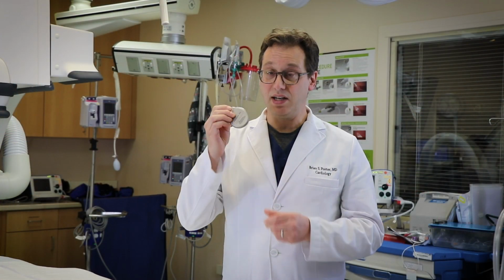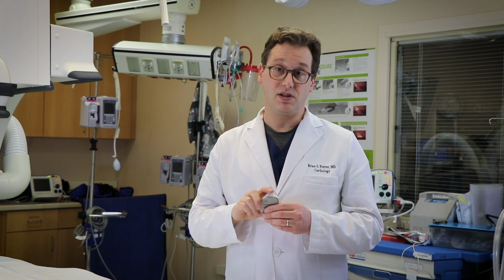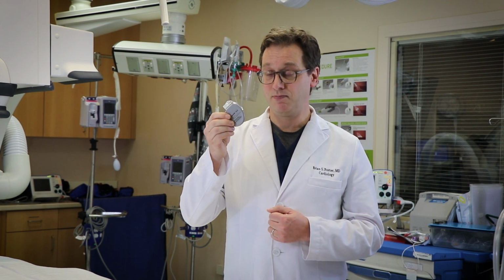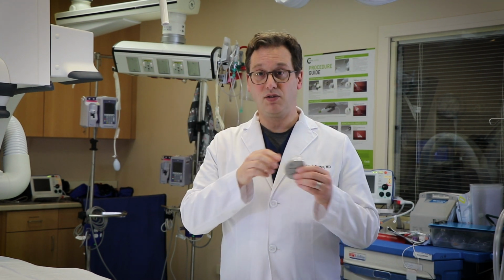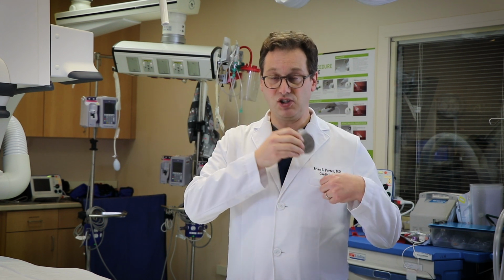Most patients with heart disease do not need one of these devices, but sometimes they do. Patients who are at very high risk for sudden cardiac death may be recommended to have implantation of an ICD. So the ICD is a little bit bigger than a pacemaker, shown here for comparison, but it's inserted in much the same way through an incision in the left or right upper chest area. The device is inserted into a little pocket that's made under the skin, and the skin is then stitched up with dissolvable stitches. Once it's installed, there may be a little bit of a lump that you can feel, but it's really not something that will ever poke out or show. And so it's inserted under the skin.